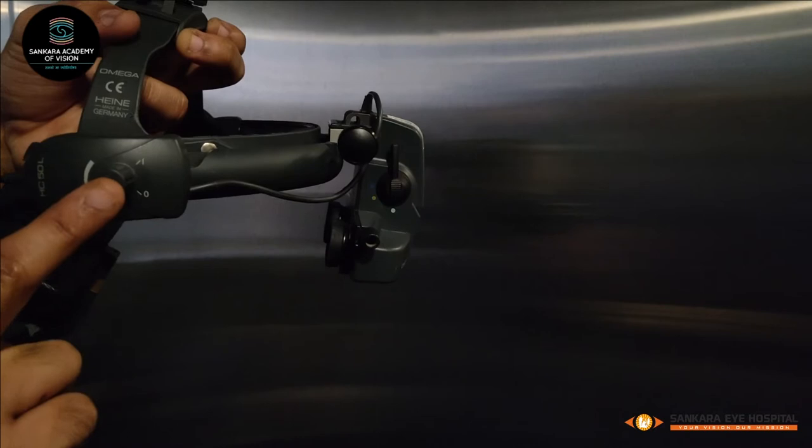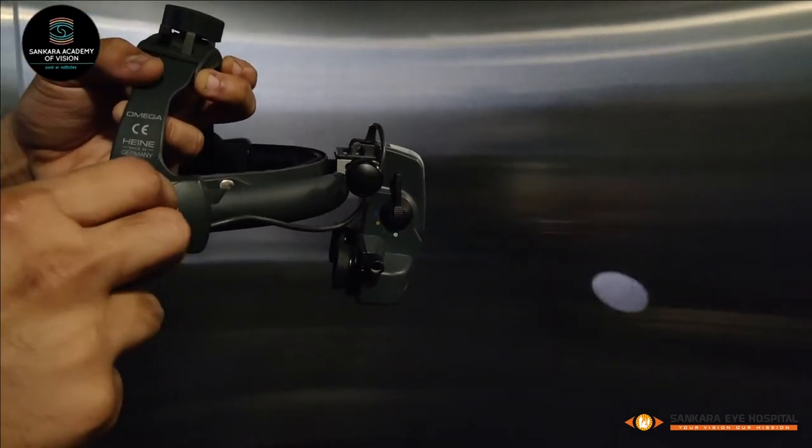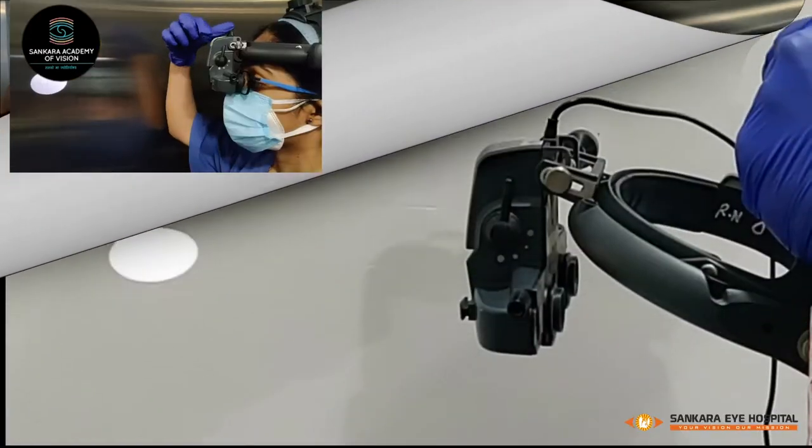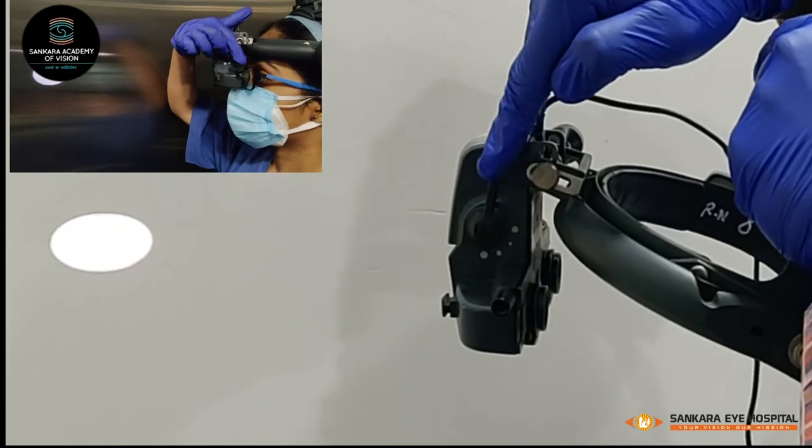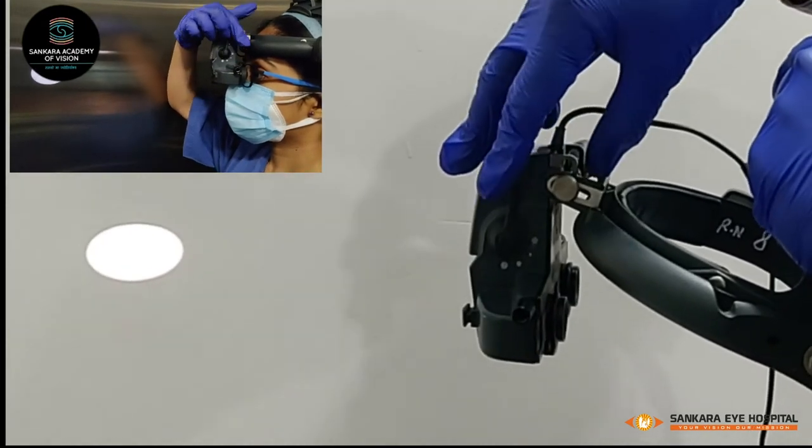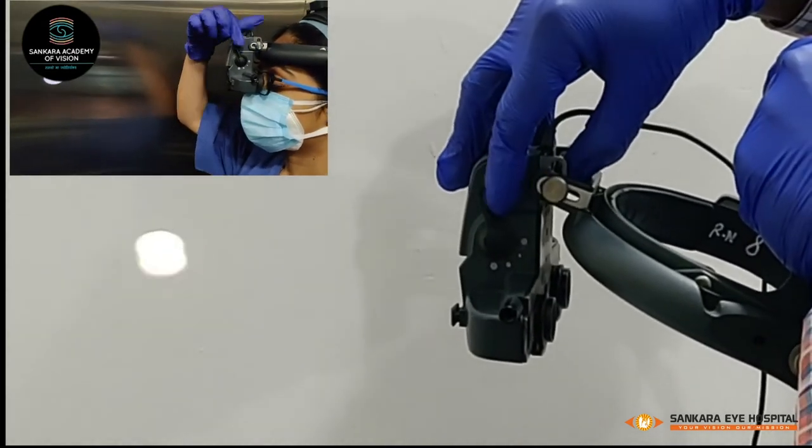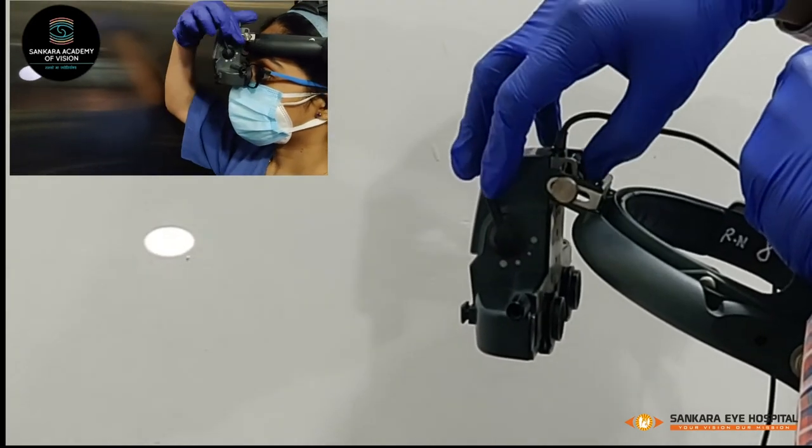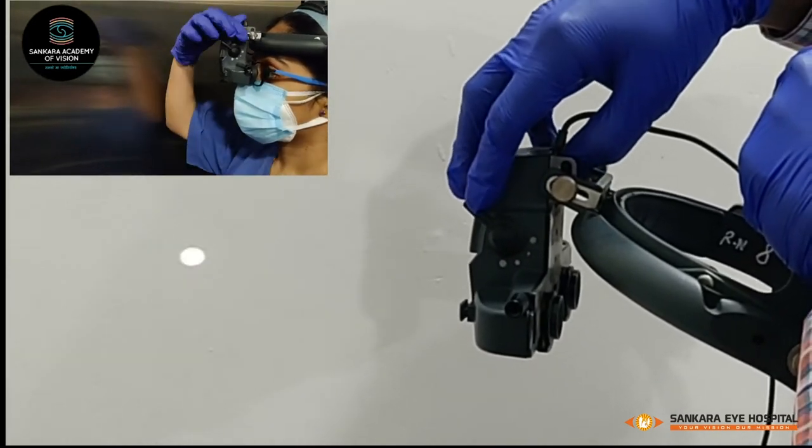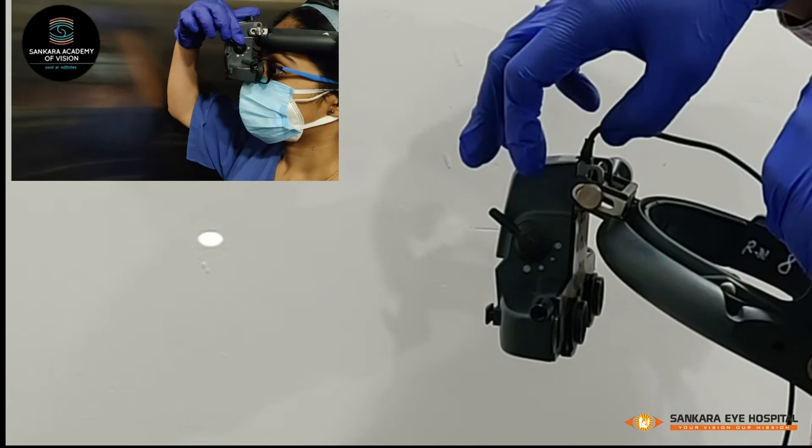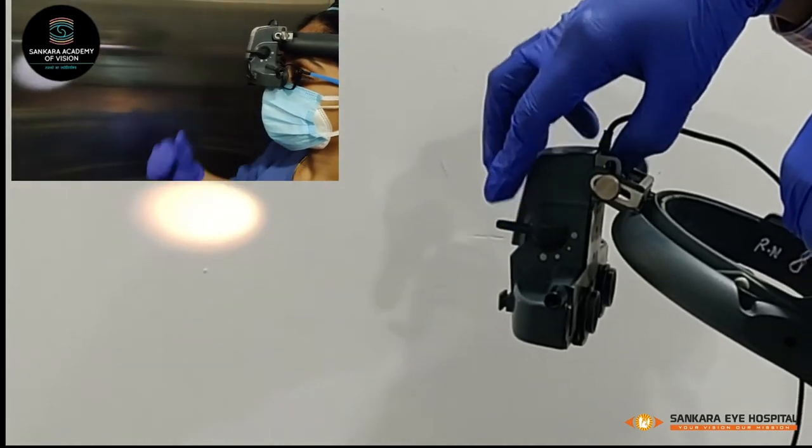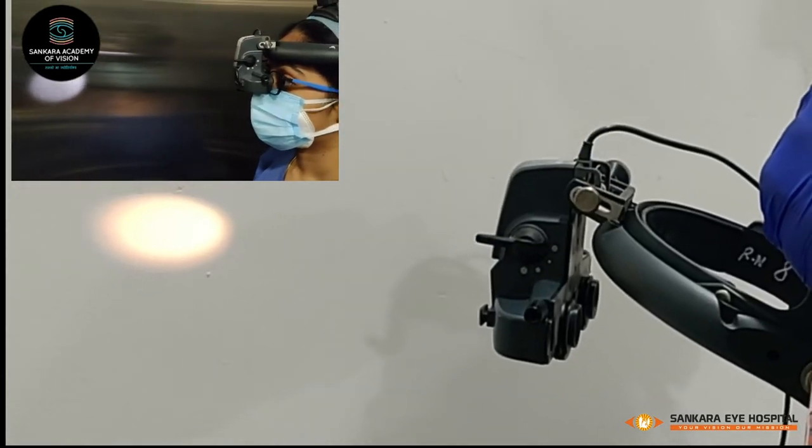A rheostat adjusts the intensity or brightness of the beam. The aperture adjustment knob provides options: a larger light spot is used for a fully dilated pupil, and intermediate and smaller apertures for a smaller or undilated pupil. The diffuser is recommended for more extensive peripheral retinal examination.